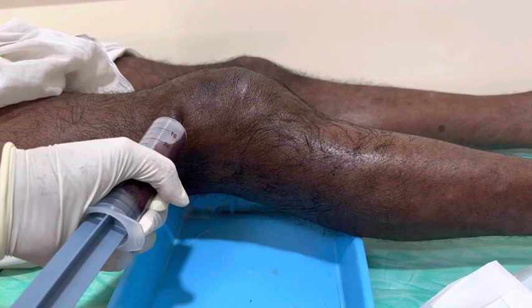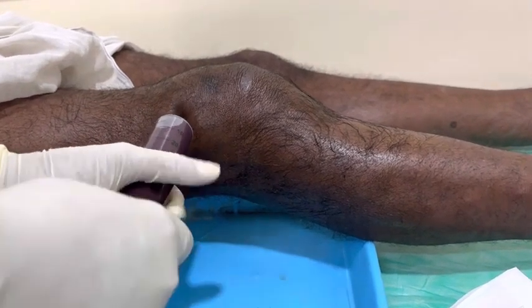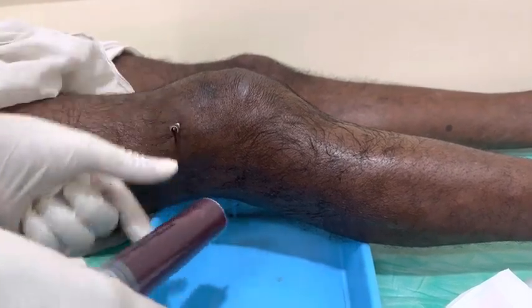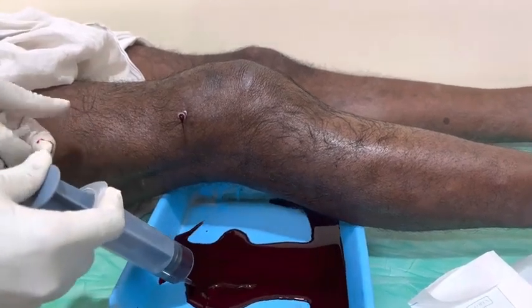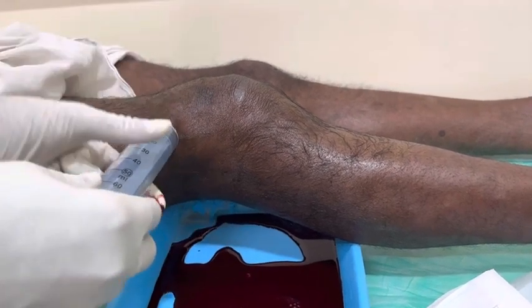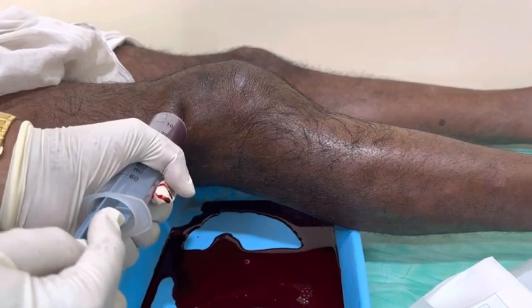As you can see, I have aspirated 60 ml of blood from the knee joint. Because of this severe swelling, he has been experiencing severe knee pain.